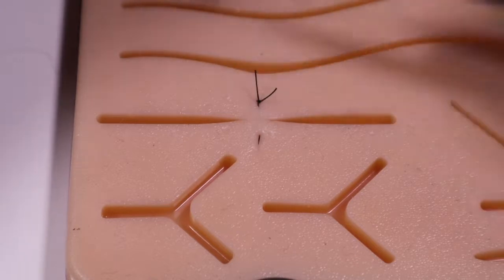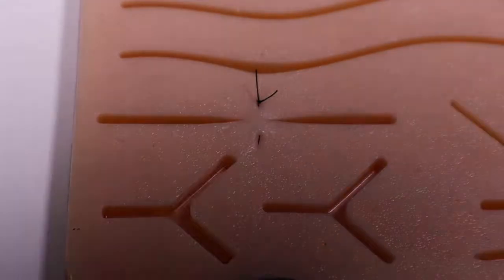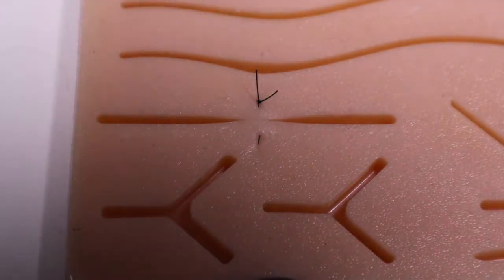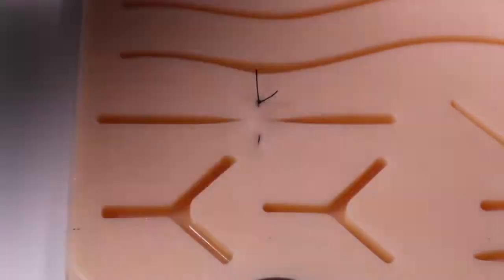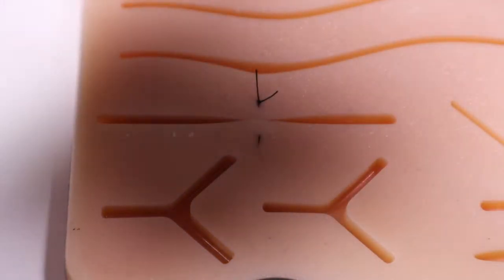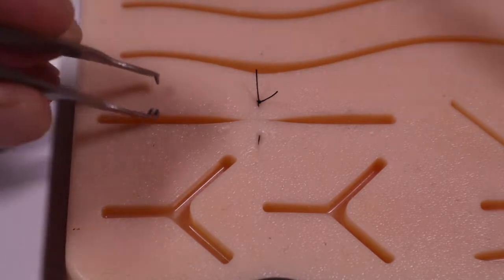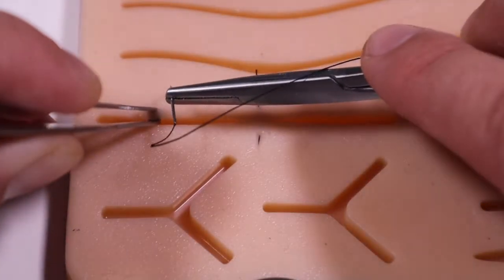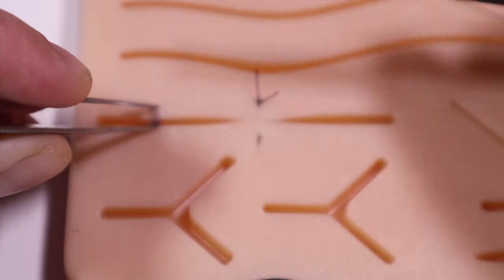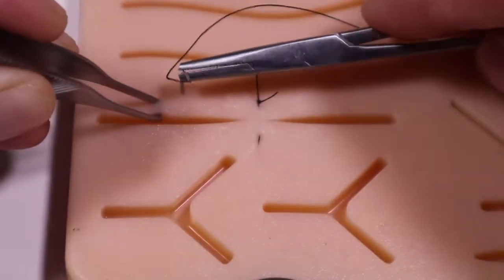Leave approximately one centimeter tail when you cut to allow for easy removal, and that's our first vertical mattress interrupted stitch. We'll divide each remaining segment by halves just as we do for our others.